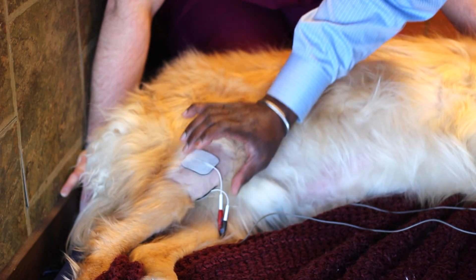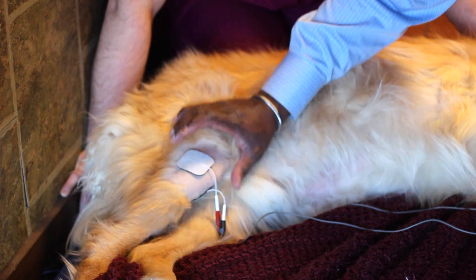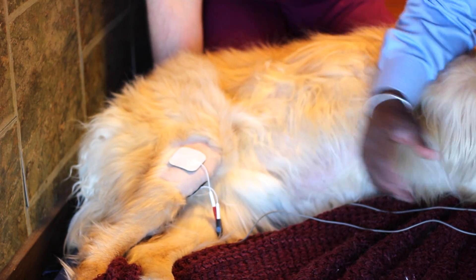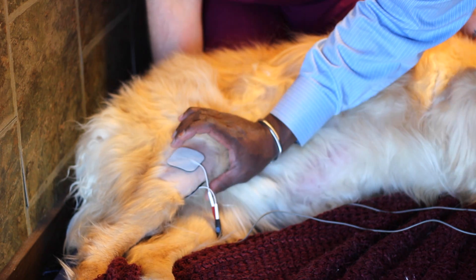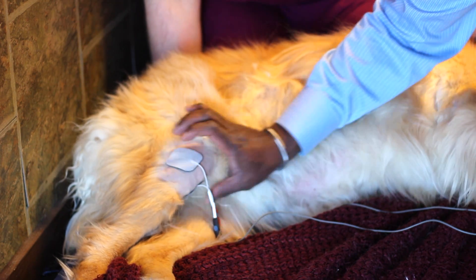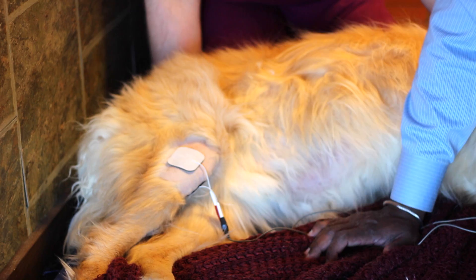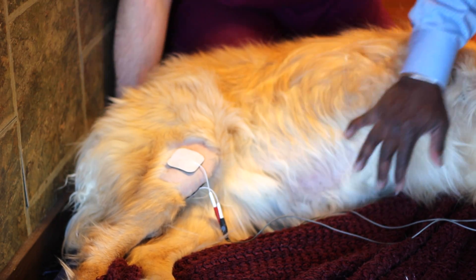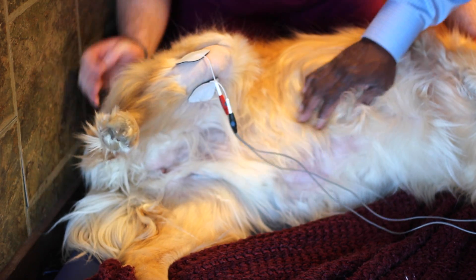Duke's leg has already been shaved, so we check the skin first for any problems, then we apply the electrodes and send a different type of current depending on what we're doing. In this video we're using the pre-mod setting to treat pain.